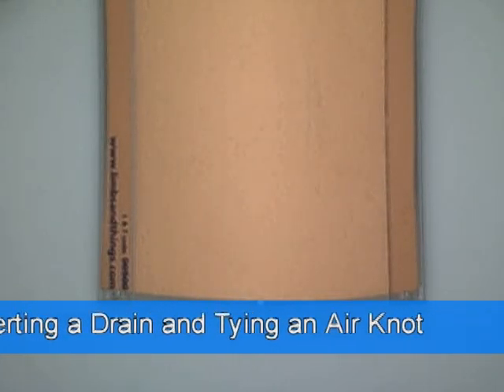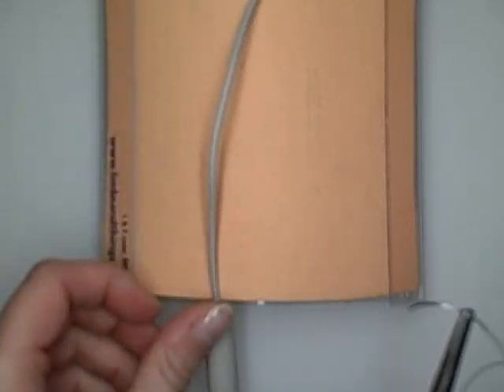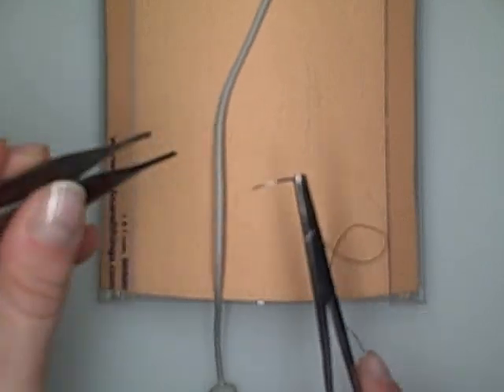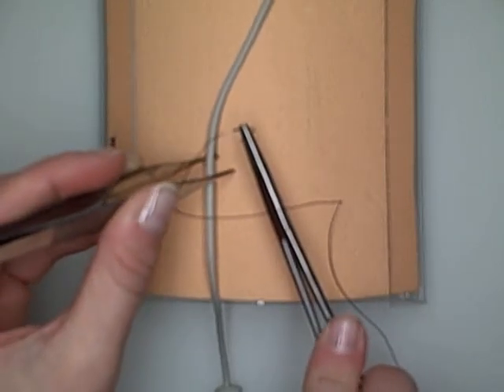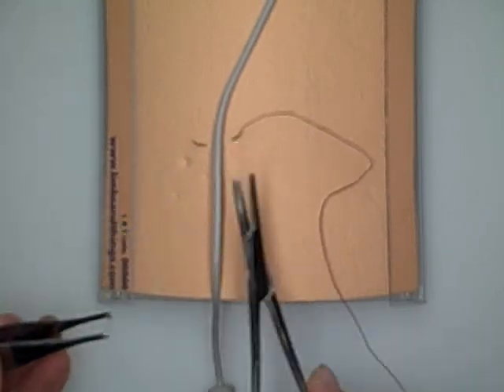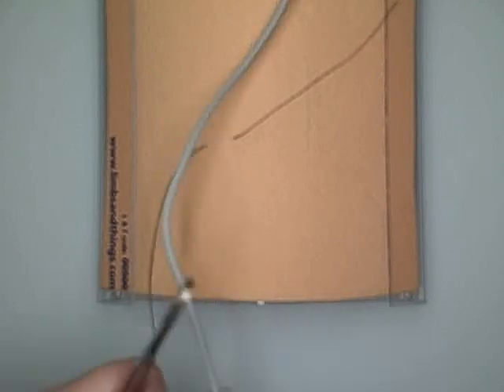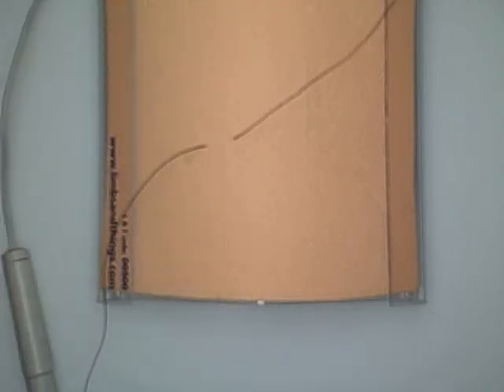This is going to be an air knot. For an air knot, we're actually going to place a drain in place — so this is our drain for today. You're going to start by going around the drain, and then you're going to pull the drain out of place.